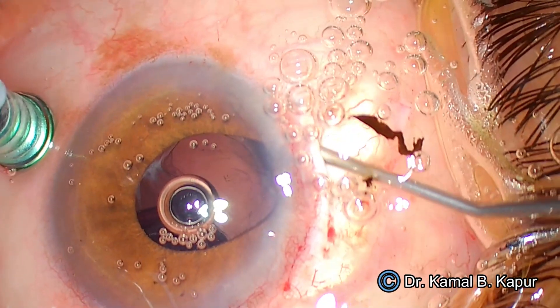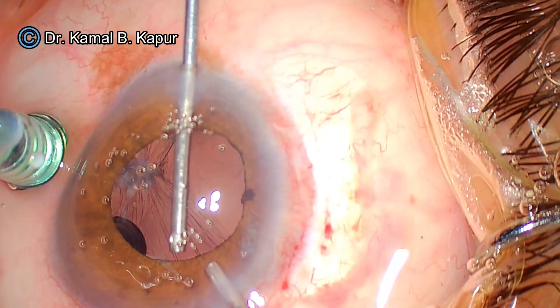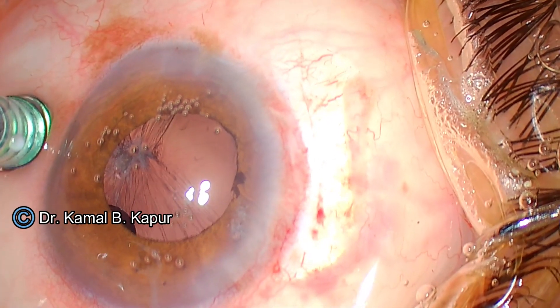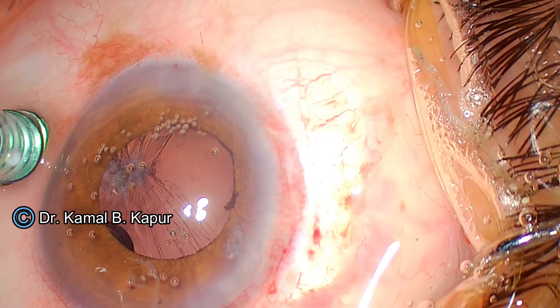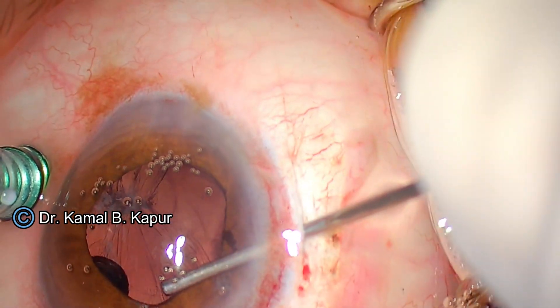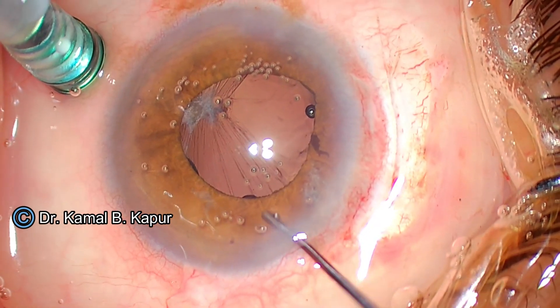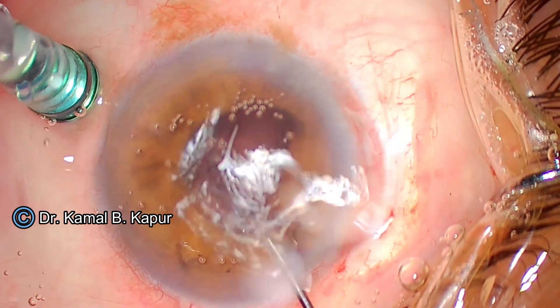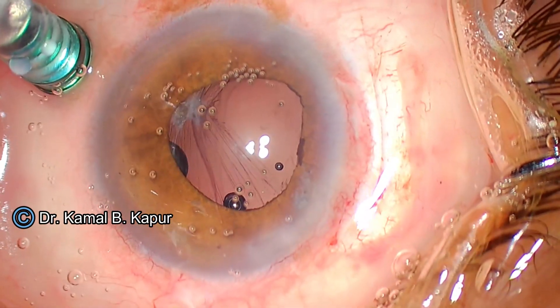Otherwise the iris will start prolapsing out. We proceed to do a vitrectomy. Notice that the pupil is going smaller due to the surgical trauma. We ensure there's no vitreous in the eye, push some viscoelastic, and use a mydriatic agent. Now trying to see the capsular rhexis edge, which was initially visible superiorly but has disappeared. There was some capsular rhexis edge visible superiorly and temporally, but it's not available now. I ask the OT technician to increase infusion pressure and pull the iris back to evaluate the capsular rhexis edge — I can see it in approximately two-thirds of the area.